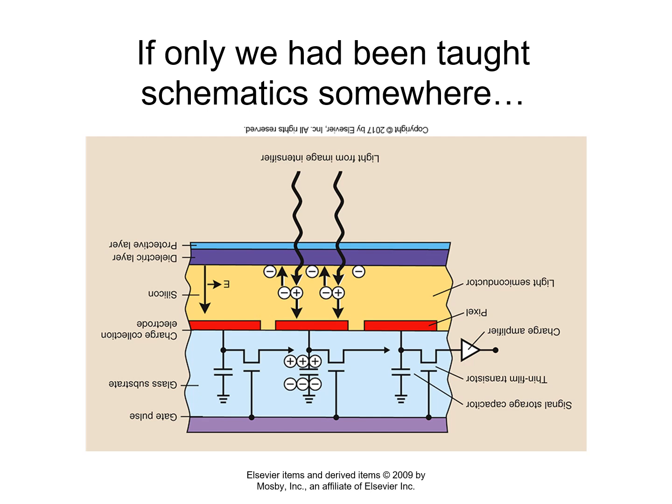The yellow part is where the photovoltaic effect is happening, okay? So when light photons pass through the first two layers, they end up energizing the silicone, and then we get ion pairs forming. The dielectric layer vacuums up those loose electrons before they have a chance to ground back out with the positive ions. So the net effect is the silicone starts to become positively charged. Well, that's not stable, so it starts looking for donor electrons elsewhere.